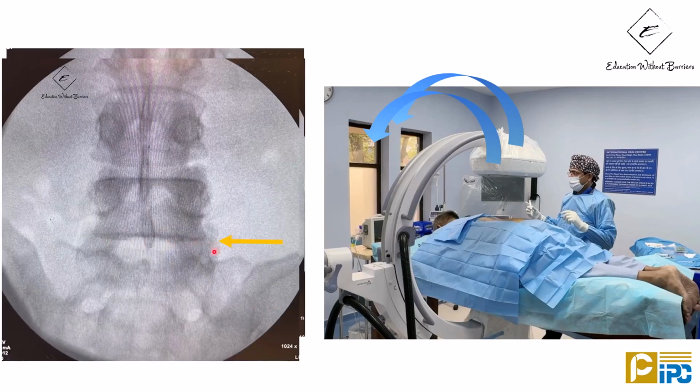So at this position, I'm looking through the L5S1 disc and I've squared my end plates. There's only one line visible over here. There is one line over here. Whereas over here, I can see two lines. The end plates are visible separately. And same goes for this level. The end plates are visible separately. So if I'm doing an L5S1 nerve root block, I have squared the inferior end plate of the upper vertebra, which happens to be L5.